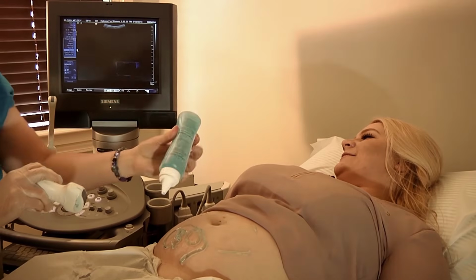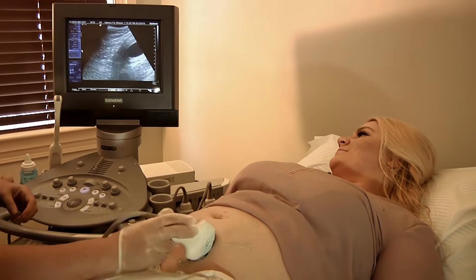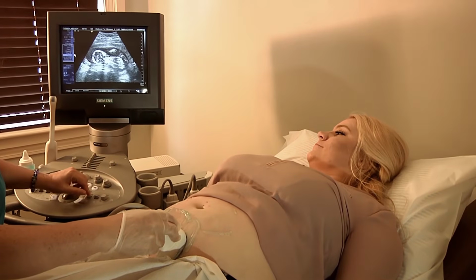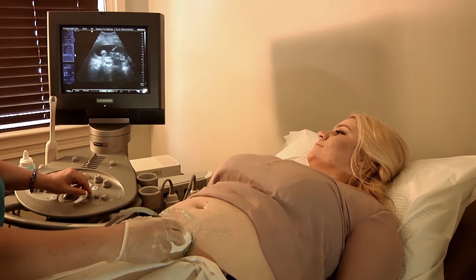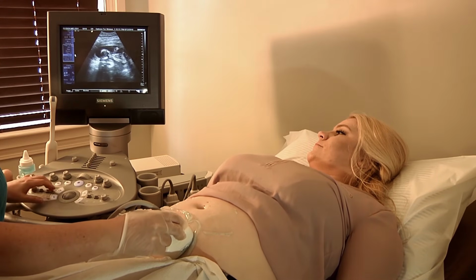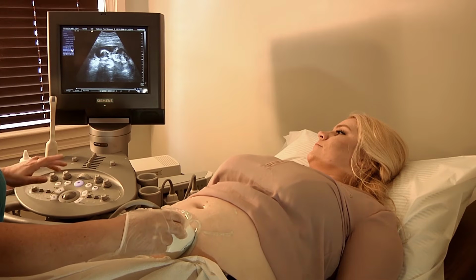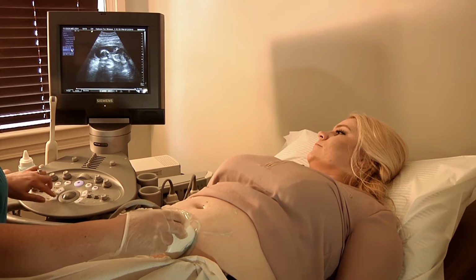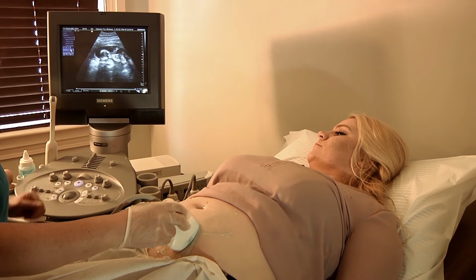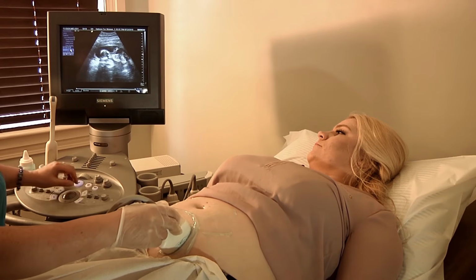I'm gonna just pretend I'm not here, and you're gonna just do your Lisa thing. Yeah, I might need... You know what? I'm gonna do something. I'm just gonna try to see if I do it here and then make it big, if it'll stay on the screen. I don't know why, it's not working, is it? That was before. I put it all the way down too.